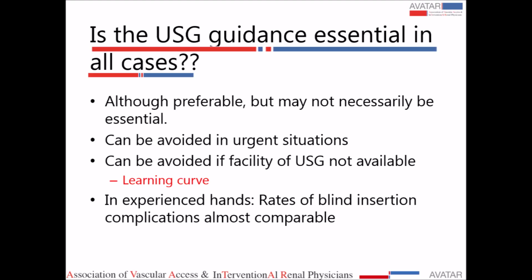So the question for all of you, which might be coming to your mind, is: is ultrasound necessary? Given all these advantages and techniques involved, is it necessary or essential in all cases? Yes, it is. It should be preferable in all catheter insertions, but may not be necessary in a few selected settings.